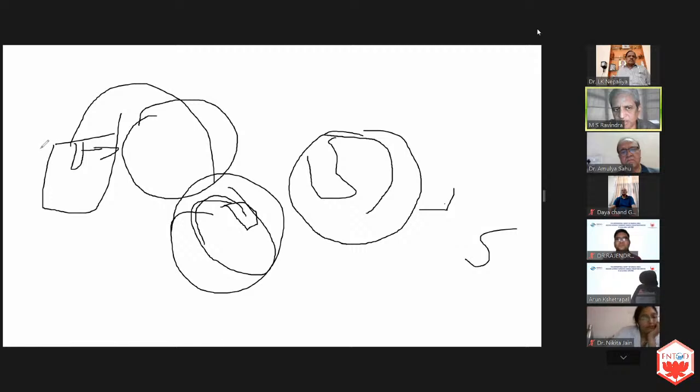So this capsule is held by the zonules, but this is being pulled. This is a tearing force. Now this tear can be brought inside. Then again, after that, you continue with the shearing. So this is what I would like to point out. I would just elaborate with this paper.